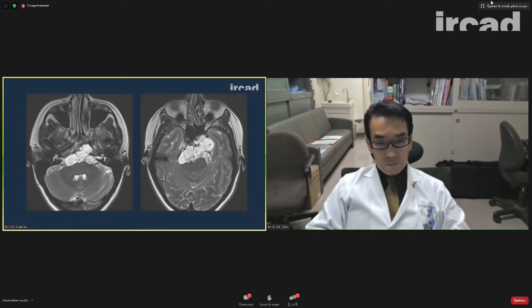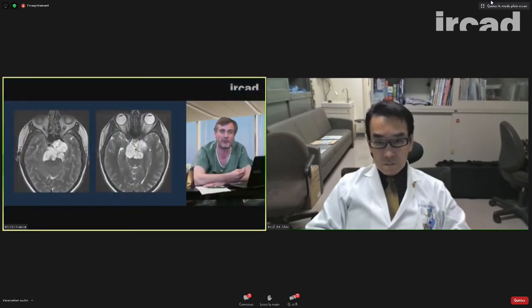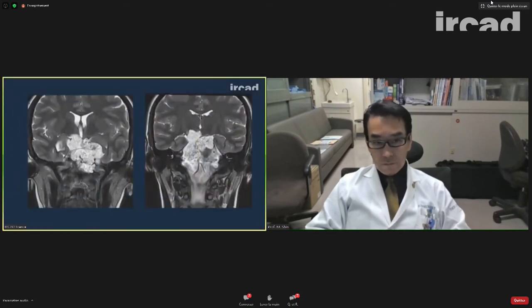Secondly, there was an important superior extension here, pushing the third nerve, especially on the right side, but also on the left, significantly superiorly. So my fear going endoscopic endonasally was not to have sufficient control of the third nerve to preserve it, because if you have a complete third nerve palsy postoperatively, it's like losing the eye. So my concern was nerve preservation, especially of the third nerve on the superior aspect of the tumor. If you look at the coronal slice, the third nerve is pushed superiorly on top of this piece of tumor here. And we could see it on the FIESTA sequences. We could see that it was completely stretched.